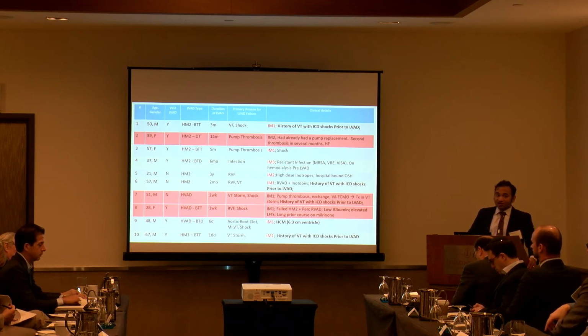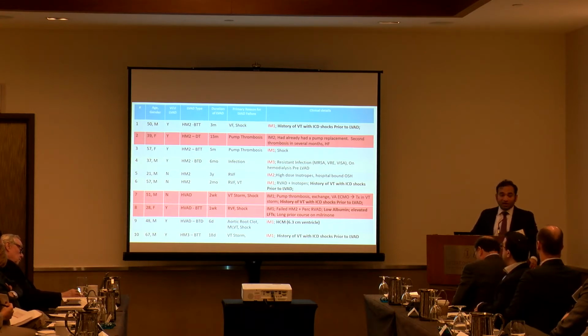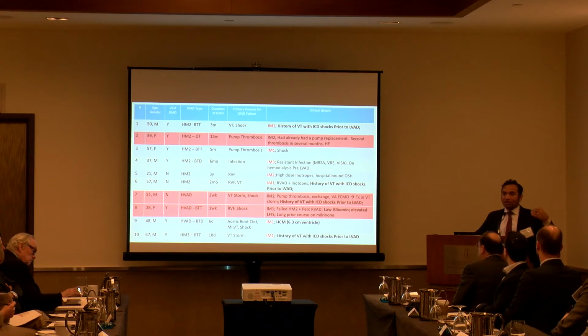The reason she did not survive to transplantation was not because of any issue with the TAH implant or TAH-related complication. This was early in the Freedom Driver experience, and after hospital discharge, she developed very high blood pressures, low flows, and failure of the Freedom Driver in the outpatient setting. Eventually, she was seen by EMS, who were clearly undereducated on the management of a TAH patient with a cardiac arrest, and attempted to resuscitate her with epinephrine in the field, which worsened the hypertension and led to further low flows.